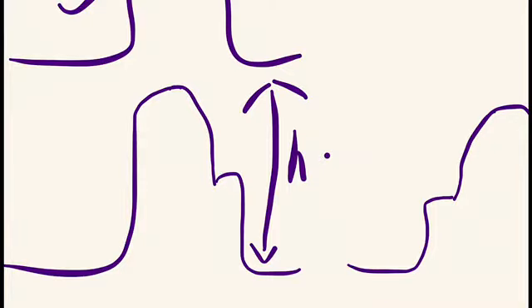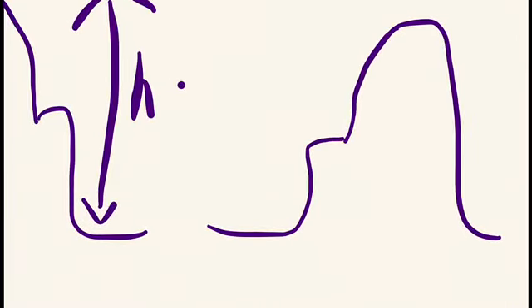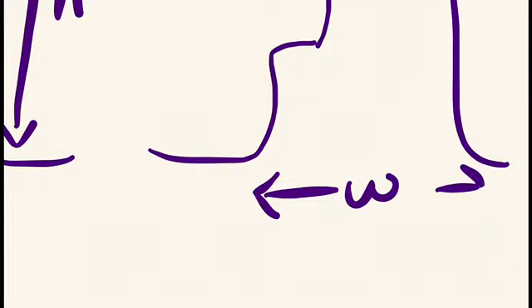Now when talking about left atrial hypertrophy, as it gives a peak in the later part of the P wave, the more effect is on the width of the P wave. So you can say that left atrial hypertrophy influences more of the width of the P wave, and right atrial hypertrophy causes more height of the P wave.